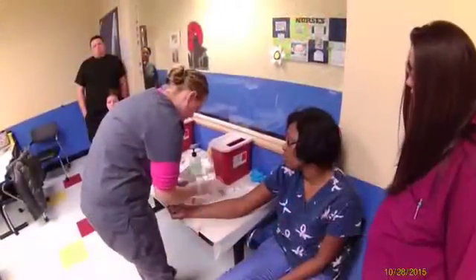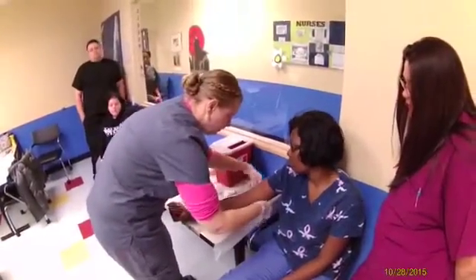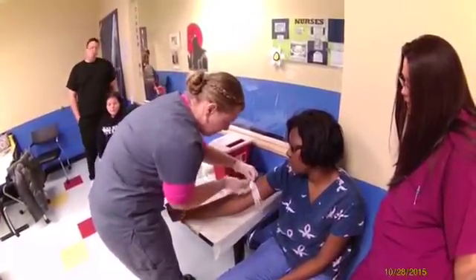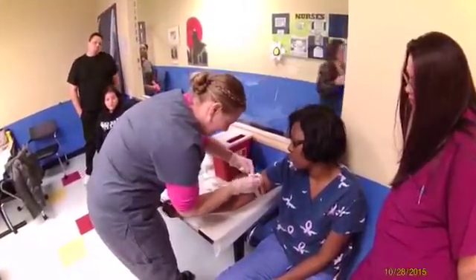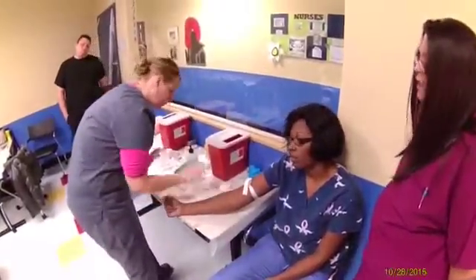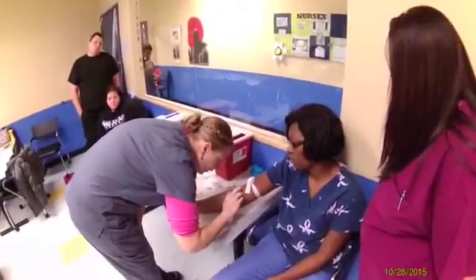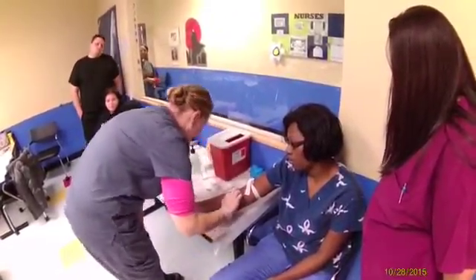We apply your tourniquet — not to touch the site, right, because it's clean. Tight, tight, tight, nice and tight. Kiara, keep pumping that fist for me — excellent, good. If you want to touch, good — alcohol on your finger.